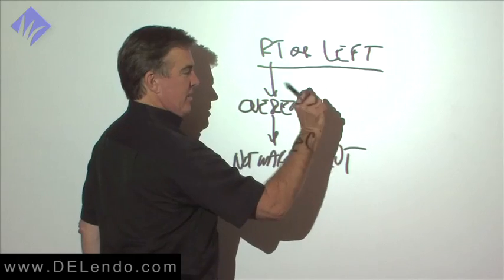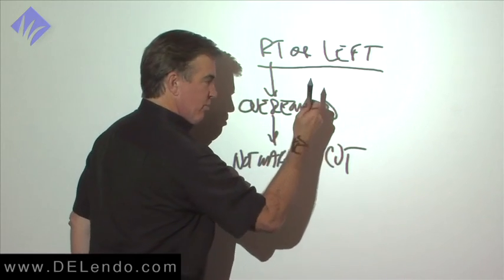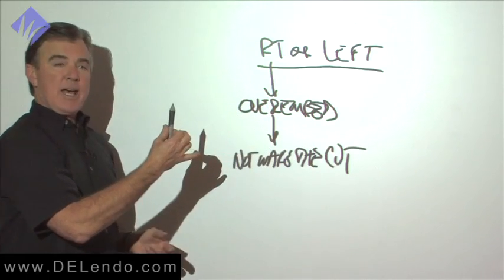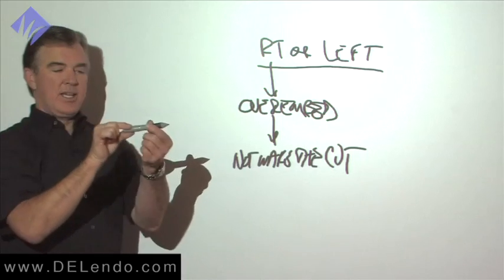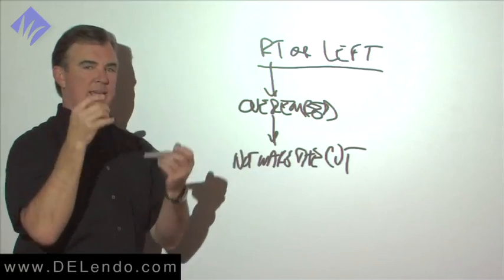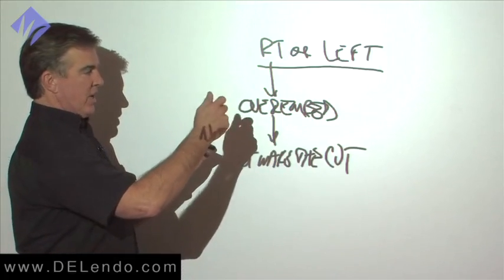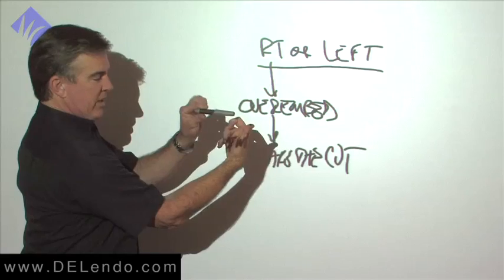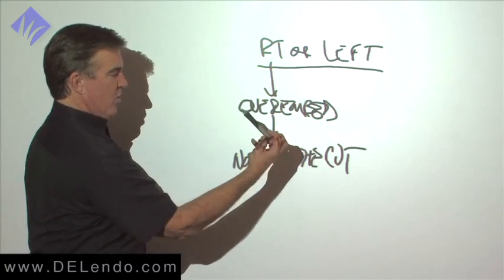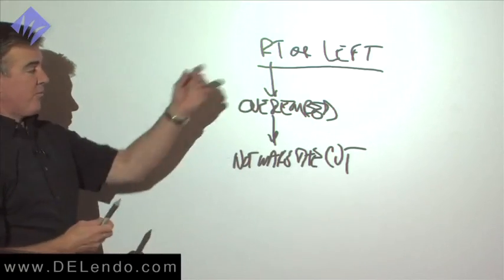Because in making the cut, we've set the blade, hopefully in this case not too far, we apply an apical pressure and we start turning it, and if I haven't held the handle of the instrument correctly, then I'm going to run out of fingers. If I'm holding the file like this and I start to counter rotate, my wrist won't go very far, maybe 100 degrees of rotation. It's never going to cut. So for us right-handers, we need to set our wrists, grab the blade, and put the handle on the side of our index finger because we can roll around there 360, 720. We can roll that handle all the way down the side of your finger and get the full 360.